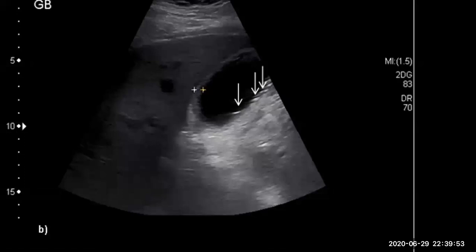Okay. Next case. Any question on this case? How can I differentiate the dirty shadow from the real acoustic shadow? The real acoustic shadow, remember the last time, the wall echo shadow sign. Yeah, okay. And this is the real acoustic shadow.